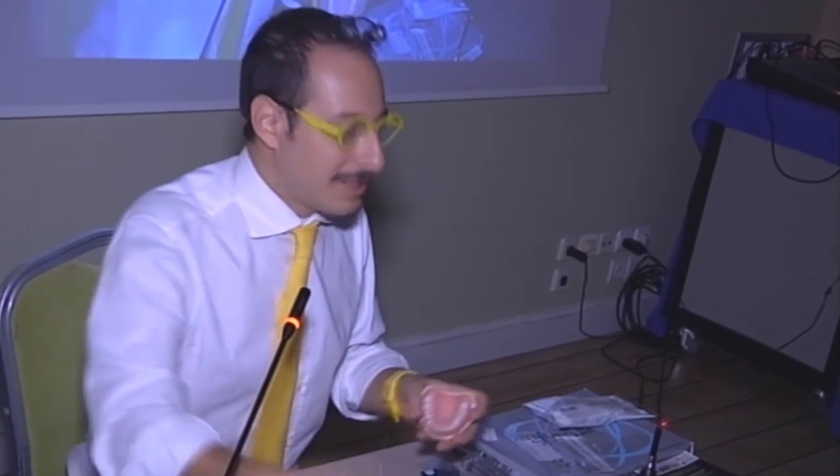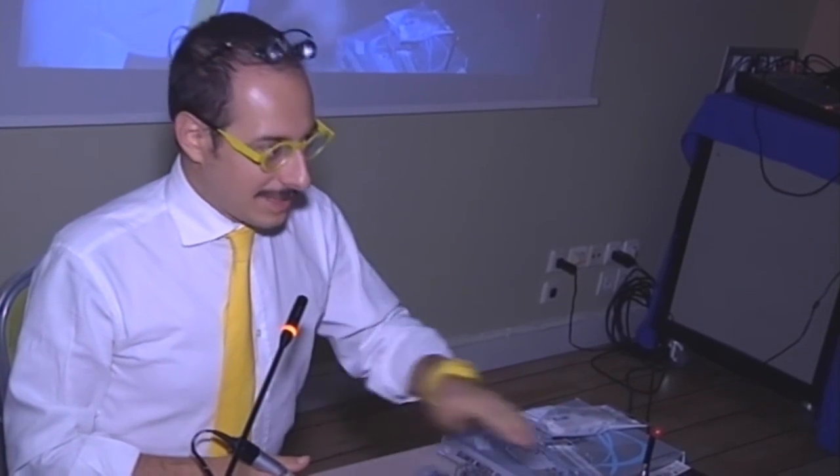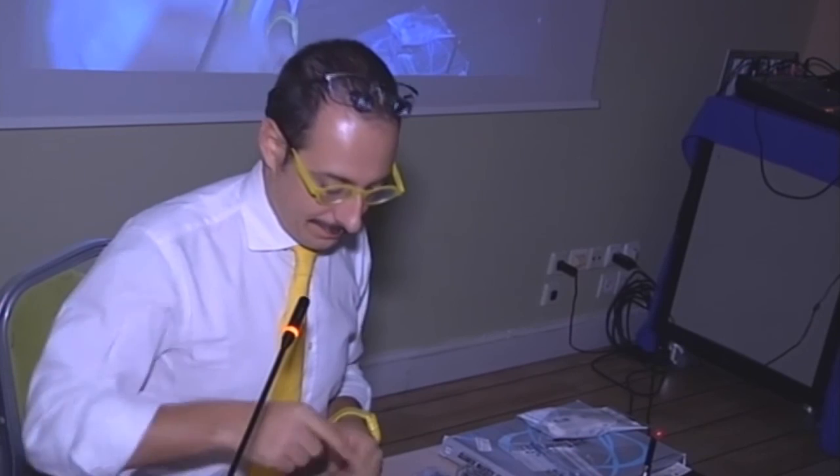So it's really mandatory in anterior teeth, of course, because otherwise you can stay hours with the brush like this, and you will not obtain any glossy surface, because there is the monomer which is uncured on the top of the surface. So you light cure the last layer, place the gel, and light cure again. 10 seconds, 10 seconds.